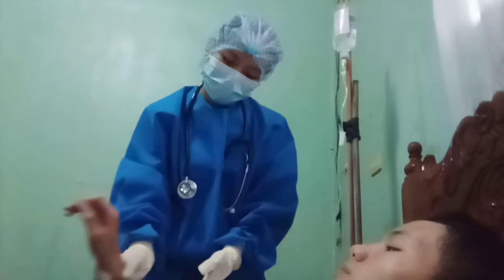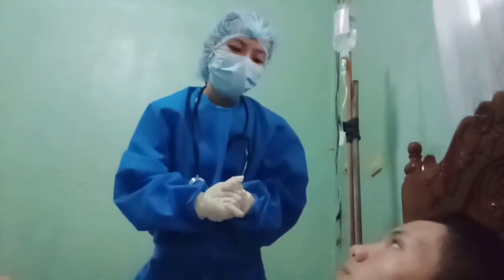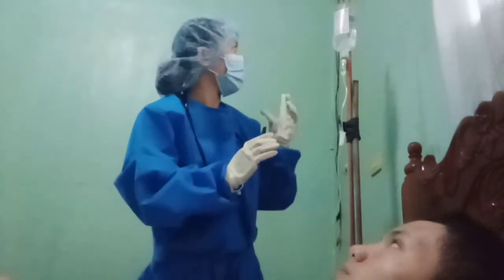So good morning, sir. I will be your nurse today. So what is your name, sir? Okay. So I want to monitor your IV fluid. Okay. This ensures patient privacy.